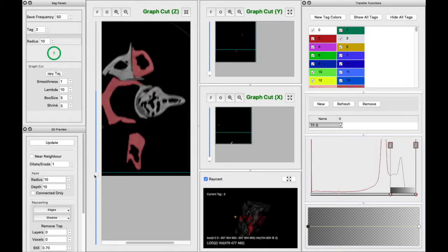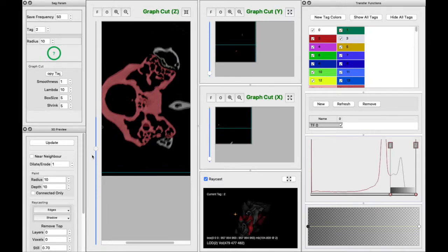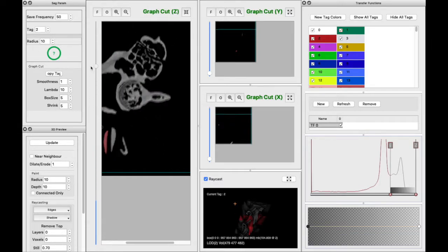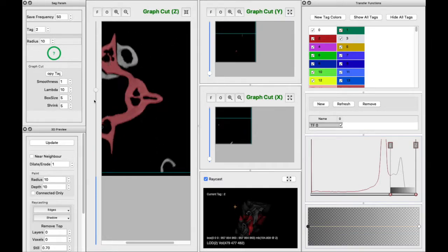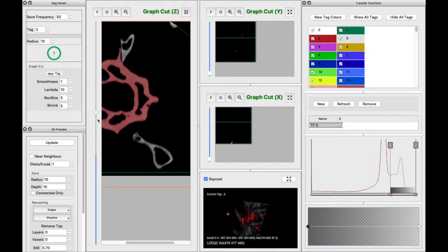But so we did all the way to here in one direction. So let's go the opposite way. Oh, wait. Oh, there was where our slices stopped. See that little cutout thing in the 3D? Like right there? I think this is where that is. We can fix that with some quick scrolling through and pressing T. Oh, and we reached it. So I don't know why that didn't fill on the reverse or the repeat process.